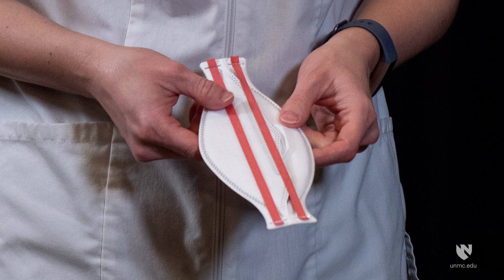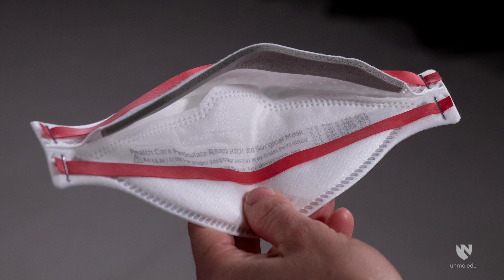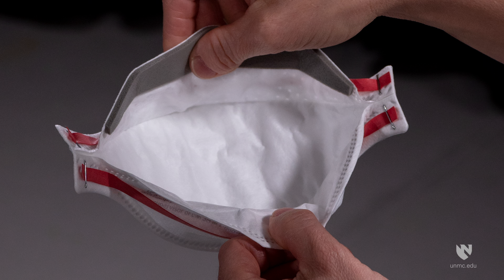Remove the respirator from the packaging and hold with straps facing upward. Place the bottom strap along the bottom panel next to the attention statement. Fully open the top and bottom panels, bending the nose piece around your thumb at the center of the foam. The straps should separate when panels are opened.